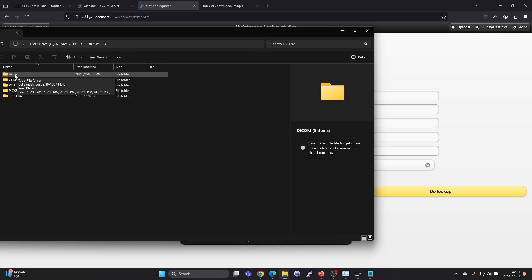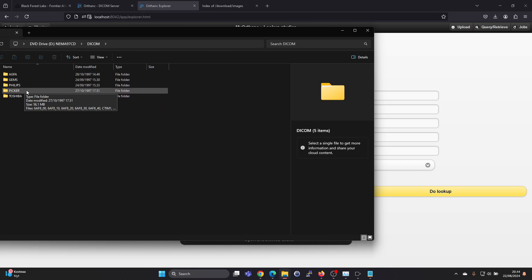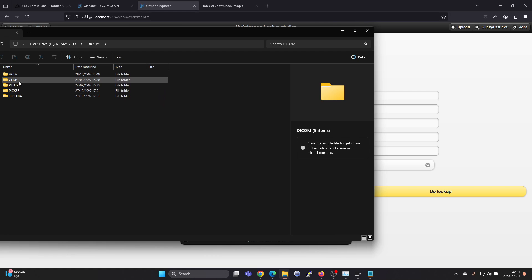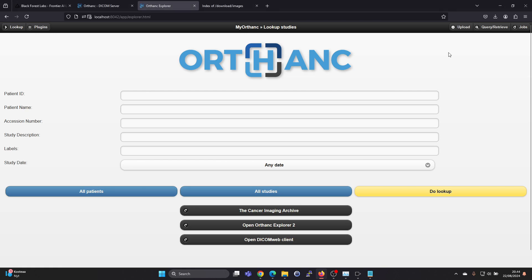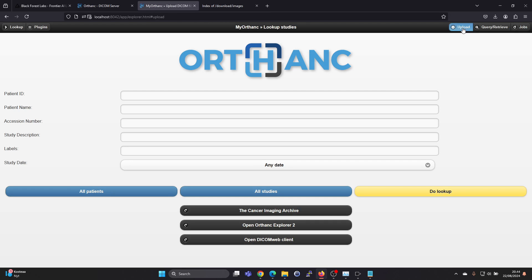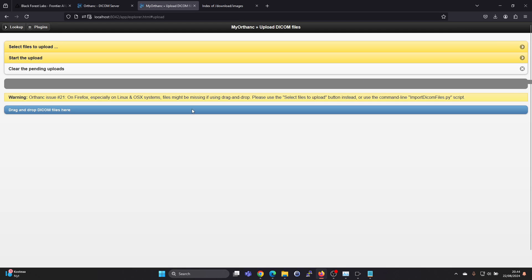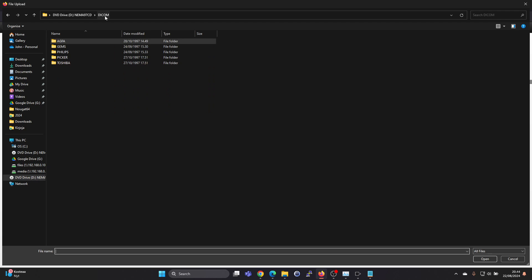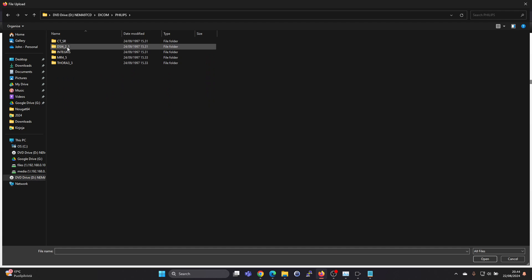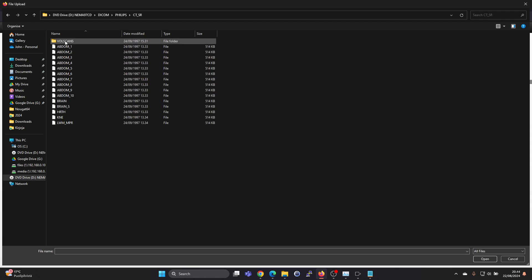And it seems we have some ACFA and some GE Medical Systems Philips images in here. So we can then go ahead and press in the Orthanc Explorer, we can press on the upload button, and we can select files to upload and just navigate to this disk.